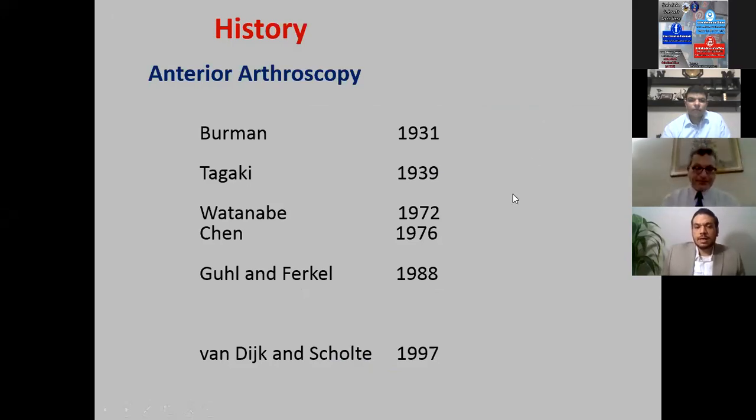In 1988 was the development of invasive ankle distraction methods that depended on pins fixed to bone to achieve ankle distraction and improve visualization. That expanded the therapeutic and diagnostic indications of ankle scope, but was later on replaced by the non-invasive distraction to reduce the complications.